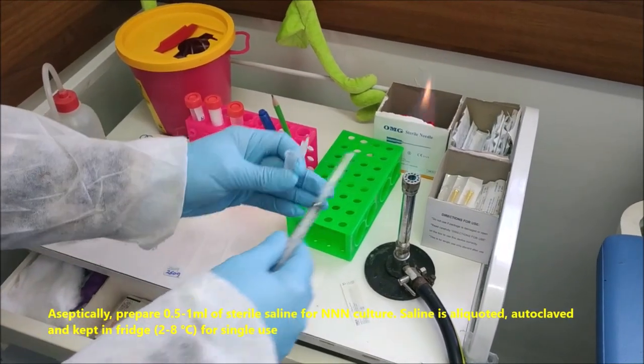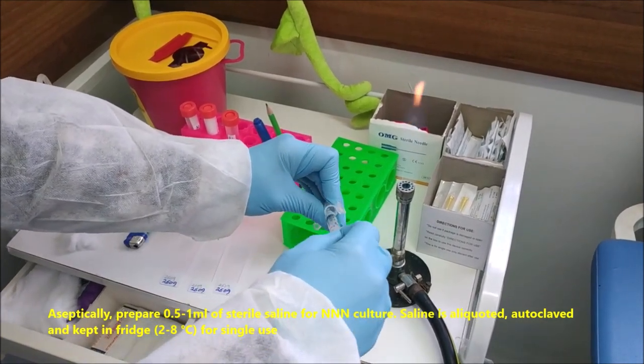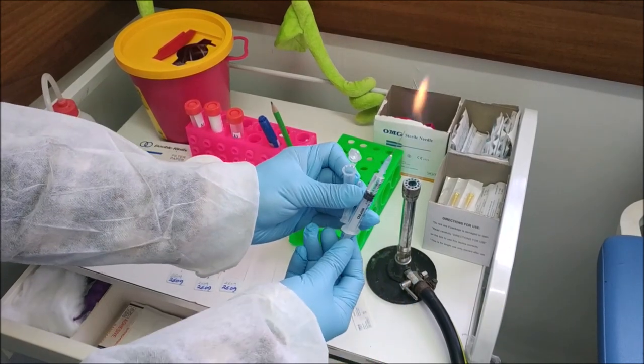Aseptically prepare 0.5 to 1 ml of sterile saline for NNN culture. Saline is aliquoted, autoclaved and kept in the fridge for single use.